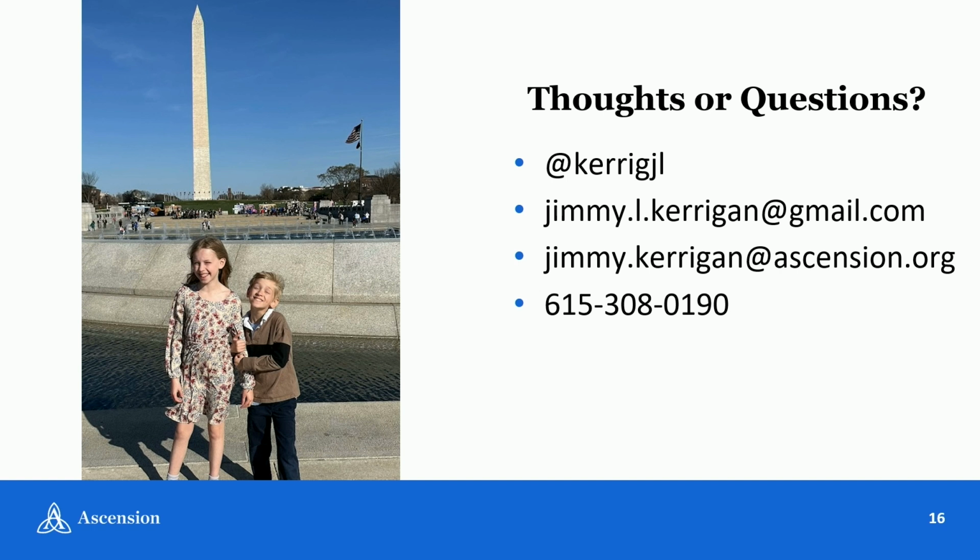I think that from a procedural standpoint, the things I'm looking at with regards to bifurcation and plaque composition, a lot of that does come off of the automated analysis, regardless of the scan quality. We also practice in a large multi-center system where the quality of the scans does differ. But I do think there's added benefit for these patients, and that's why I try to get this on every patient I can who doesn't have renal dysfunction, because it is quite useful and potentially prevents unnecessary procedures, regardless of that quality.